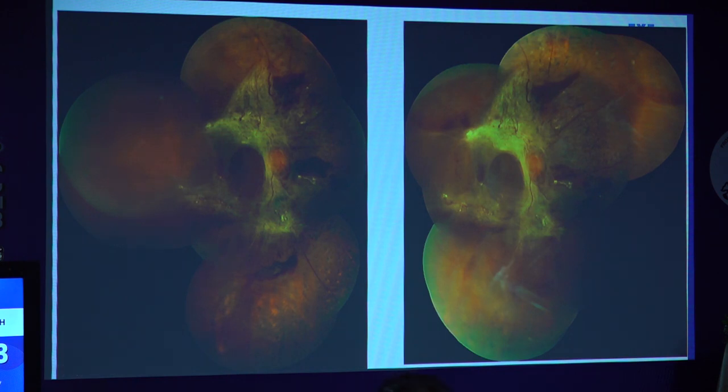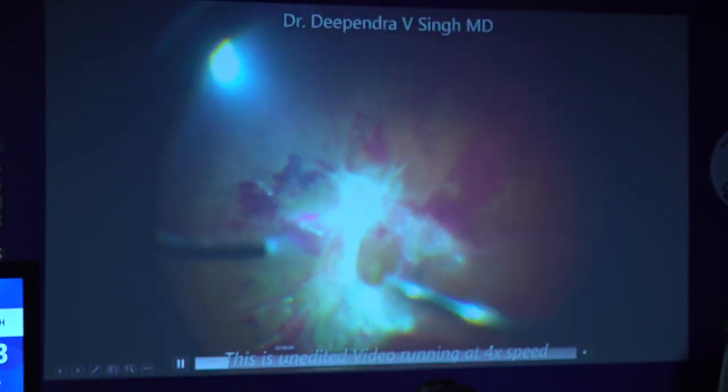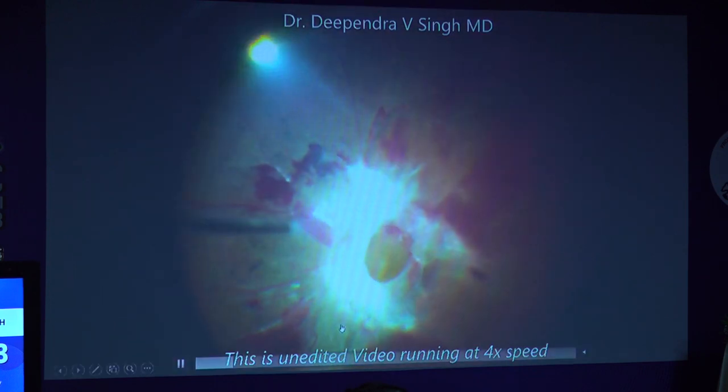When you are operating these cases, Dr. Reddy has already laid out that your strategy is to address it from outside and leave the thickest membranes to the end. I'll just take it forward from there. So this was again a very aggressive PDR TRD in a young patient. This is actually an unedited video. When we are discussing going bimanual and going around the neovascularizations without disturbing them, what do we mean?